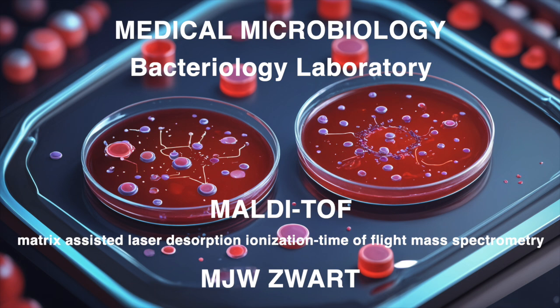The matrix solution, think of it as the unsung hero of MALDI-TOF. Okay. It's a special solution that absorbs the laser energy during analysis and helps the protein molecules ionize, which is essential for them to be detected by the instrument. You know, the document specifies using these HCCA matrix crystals. HCCA, yeah. And they have to be completely dissolved in a specific solution. Acetonitrile, water, and trifluoroacetic acid. Trifluoroacetic acid, yeah. And they even emphasize vortexing that solution for at least 2 minutes.